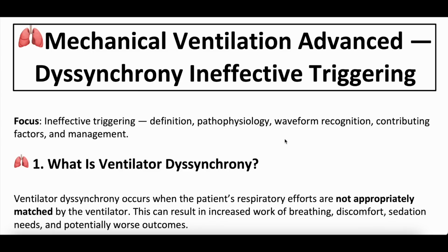Today is going to be another mechanical ventilation video, particularly focusing on a type of desynchrony known as ineffective triggering. This was a request by some of you, so we certainly appreciate requests. Hopefully we live up to what the origin of the request was, and let us know if there's other requests. We're always trying to do anything we can to improve everybody's experience.